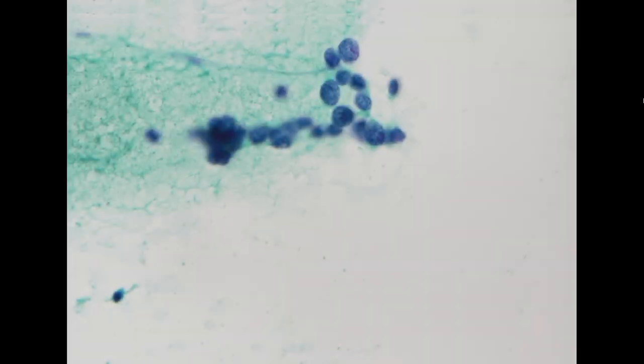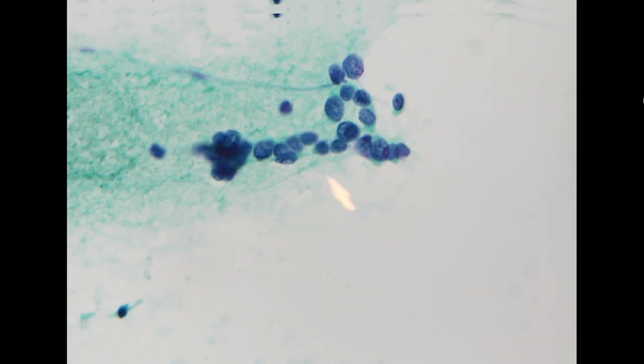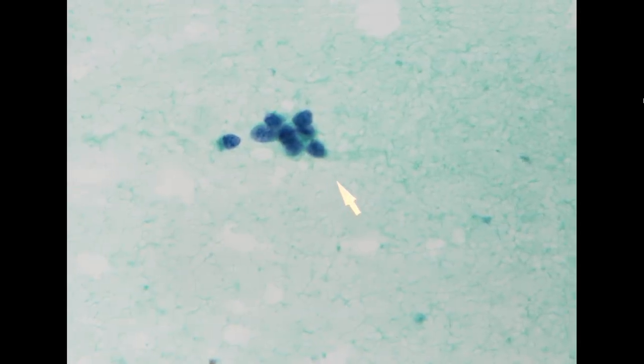We have some blood and we also have some aggregates of atypical cells. These atypical cells show increased NC ratio, hyperchromasia, and the chromatin pattern is coarsely granular. In a 56-year-old female, just based on the morphology, it is positive for carcinoma, but we see this hyperchromasia, coarse chromatin type of pattern. It looks a little bit squamoid just based on the Papanicolaou stain.